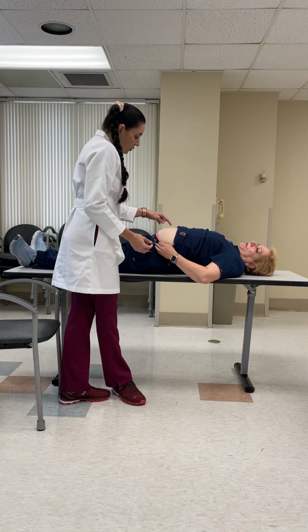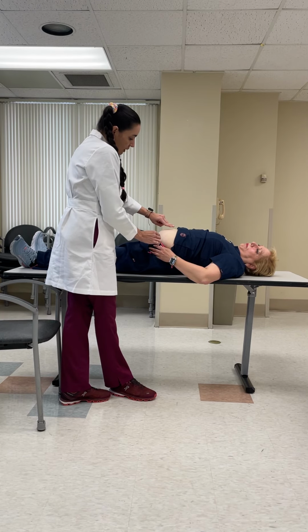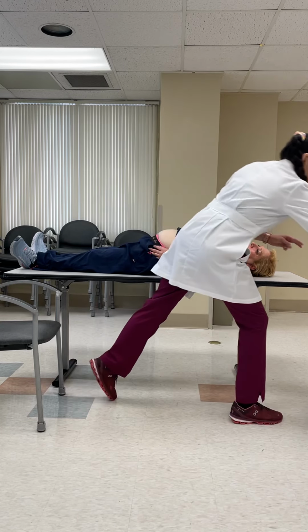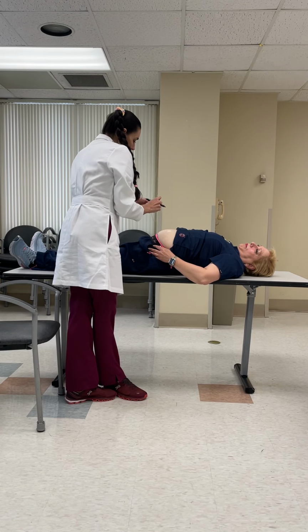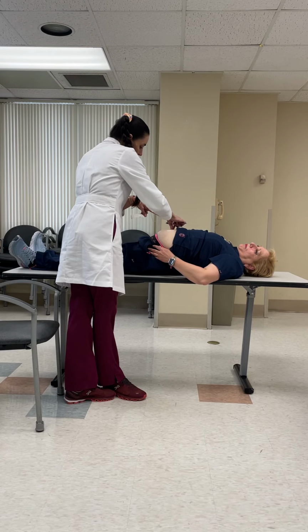The other way you can do it is to mark a line from the umbilicus to the iliac crest, and usually two inches along that line. That's where we're going to place the stoma marking site, either for colostomy or for ileostomy.